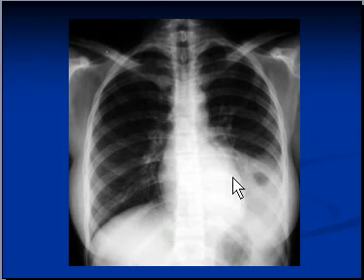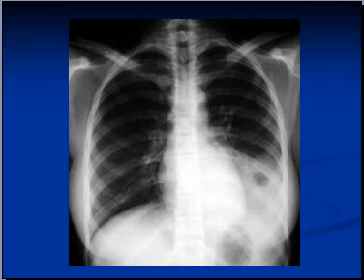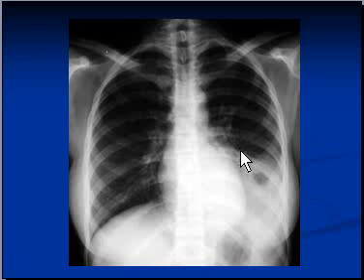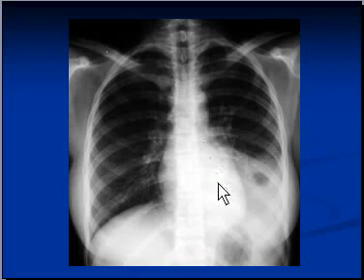Another X-ray shows consolidation in the left lower zone, but the left cardiac border is still clearly visible. This indicates that the pathology is most probably in the lower lobe, which lies posteriorly. Since the normal lung tissue of the left superior lobe is bordering the left heart border, that border remains clearly visible. The heart is located anteriorly, and the tissue bordering the heart still has air in it.